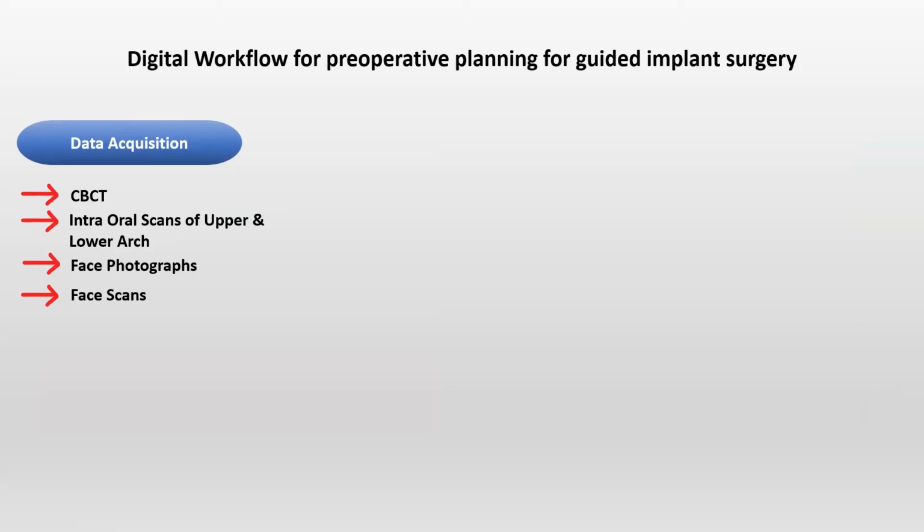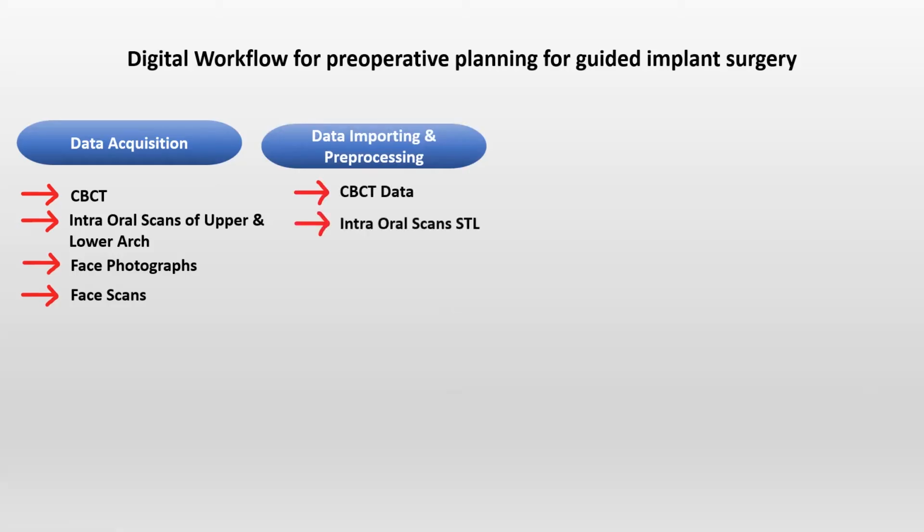Once this data acquisition is done, we move on to data importing and pre-processing. In this, we first import the CBCT data, and then we import the intraoral scan STL files of the upper jaw and the lower jaw into the planning software.